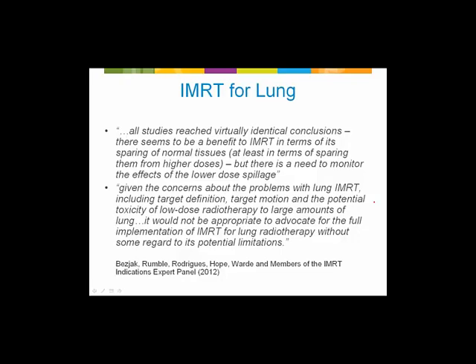Now, target definition, that's a big issue. It's really a talk unto itself. A lot of us will use multimodality imaging to introduce functional aspects to our target definition. For example, PET.